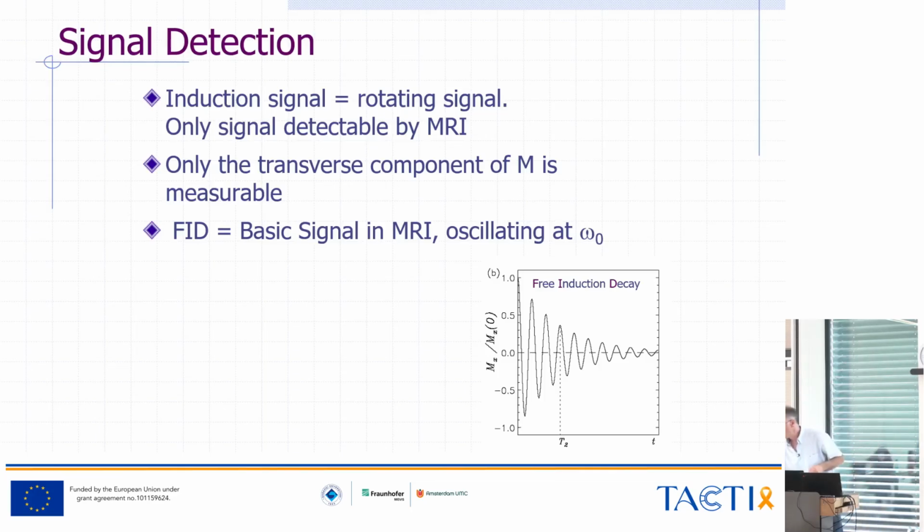Are you already asking me to stop? 2 minutes. Just having the spin echo explained.